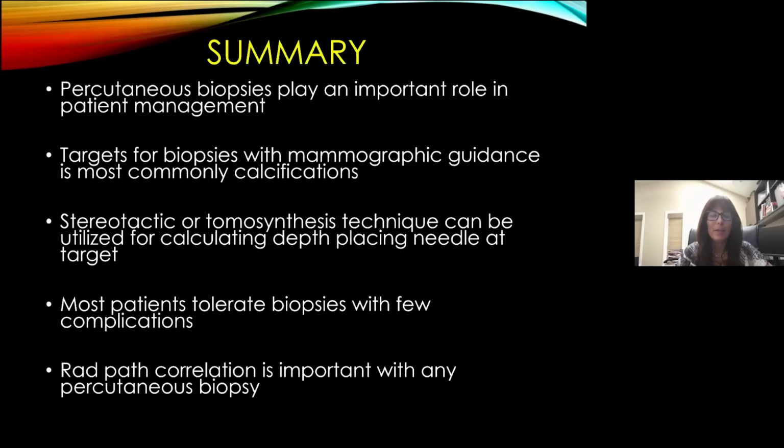So in summary, I hope that I've shown you that percutaneous biopsies play an important role in patient management, whether or not the targets are benign or malignant. The most common target for a mammographic-guided biopsy is a group of calcifications, although other targets are appropriate, such as masses, distortions, and asymmetries.